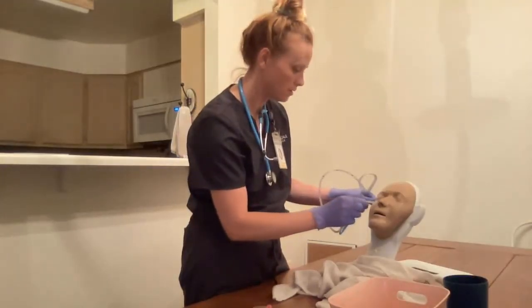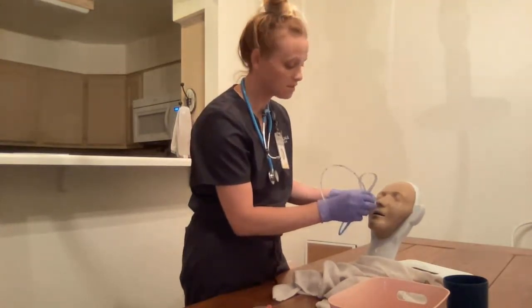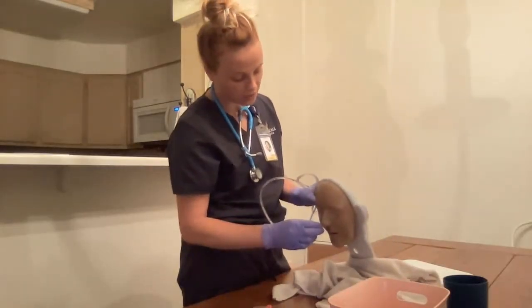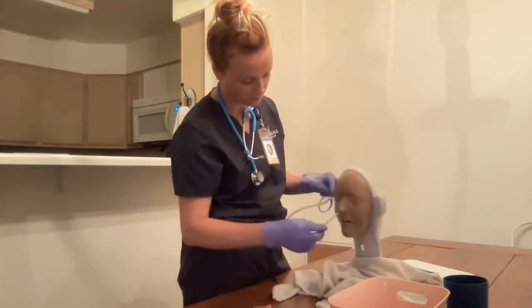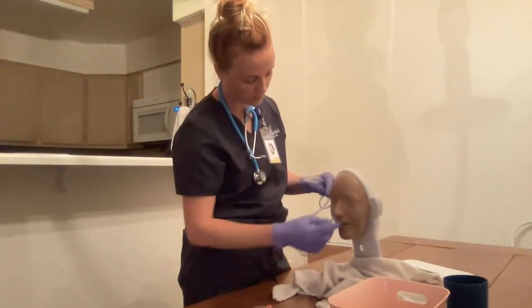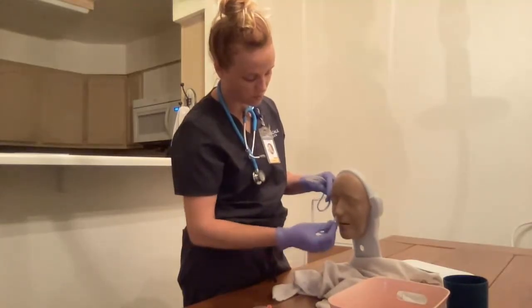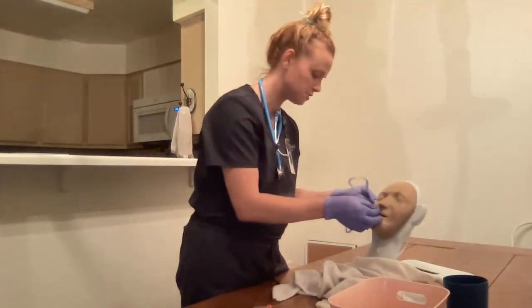Inserting. Good. Good. All right, my patient is now gagging. Mrs. Smith, lean your head forward. Good. All right, I want you to swallow. Each time you swallow, I'm going to insert the tubing, okay? Swallow. There you go. Swallow. Swallow. Swallow. All right, I have met my mark, 50 centimeters. Mrs. Smith, just relax.